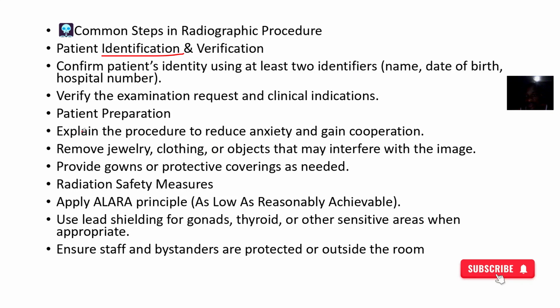So, patient preparation. This way, at least you don't handle the patient as if the patient is an animal. At least you have to converse. You introduce yourself. So this is the radiology department, you were sent from your ward and we are supposed to do some procedure. During this procedure, these are the things that will happen.